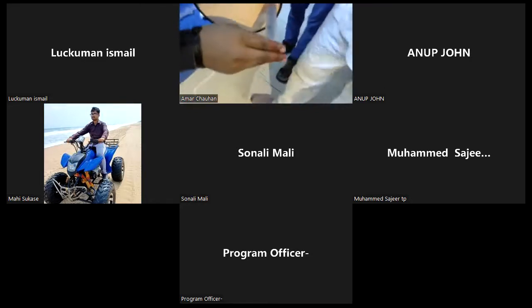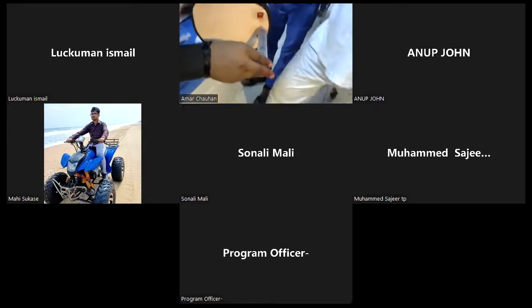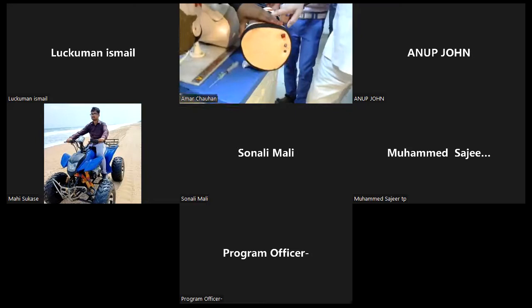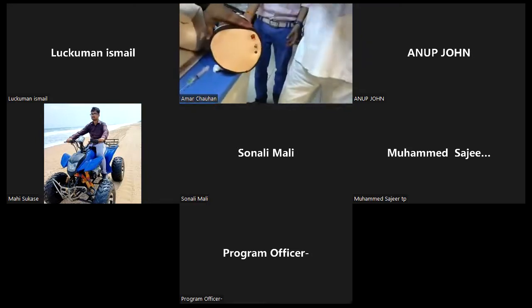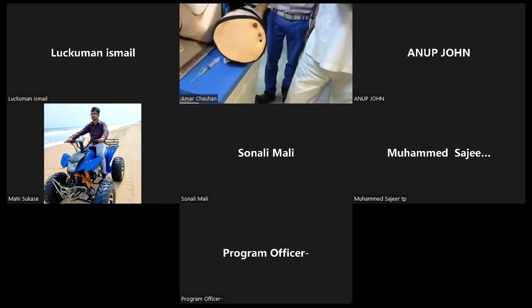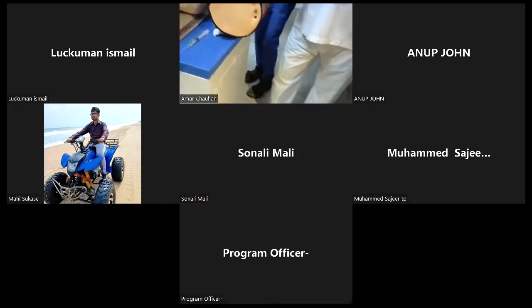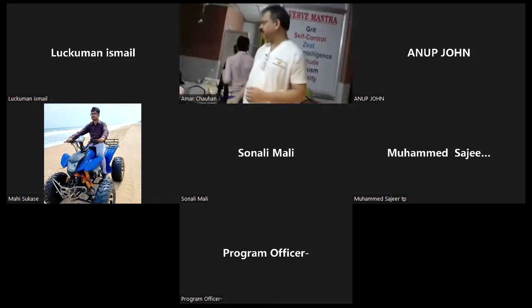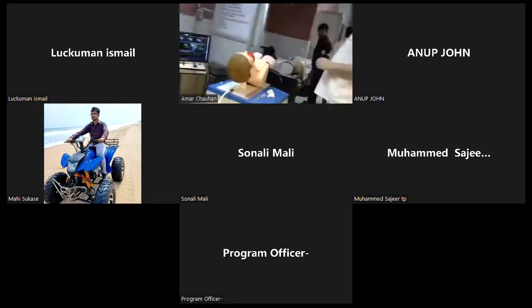Yes. We have given a port in the center line also, in the pericardial center. Wherever we have blood circulation, we have given a port for refilling. In every mannequin, there is a port. It's a very simple method. But for IO access, you have to buy the pad, which is not refillable.